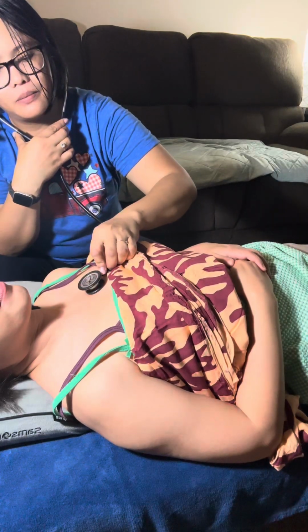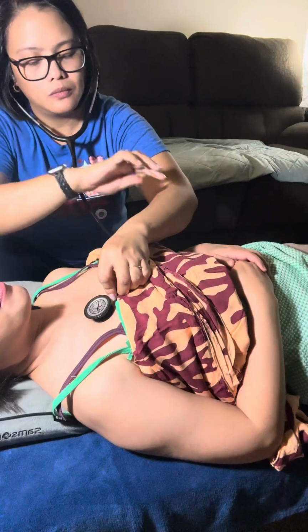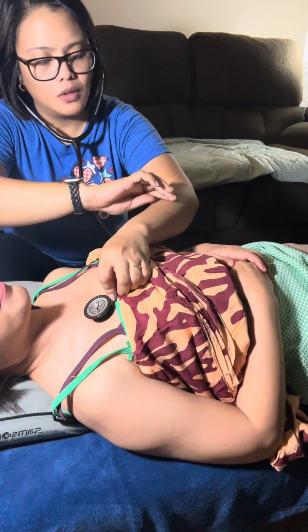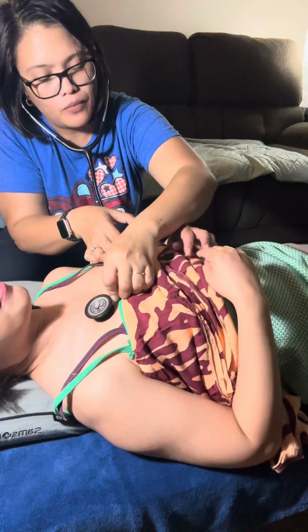Aortic. Normal rate at like 72. Pulmonic. Normal rate. Rhythm is regular.